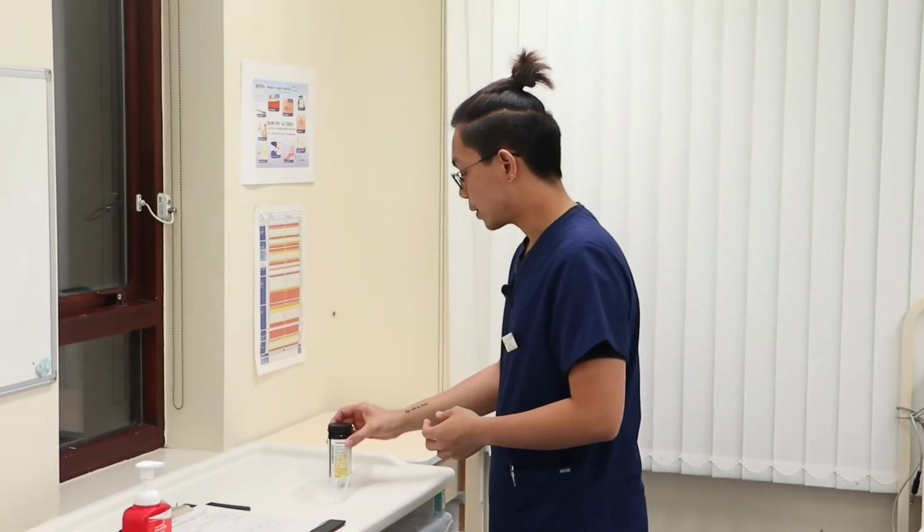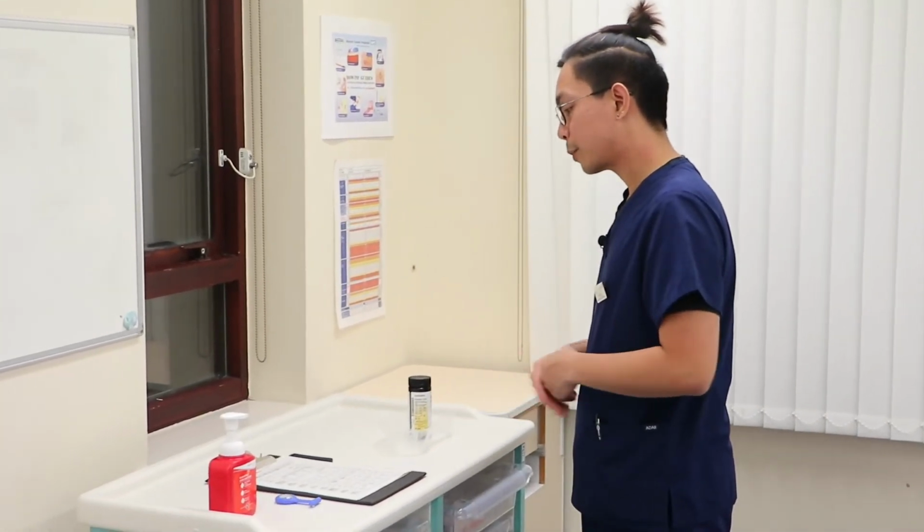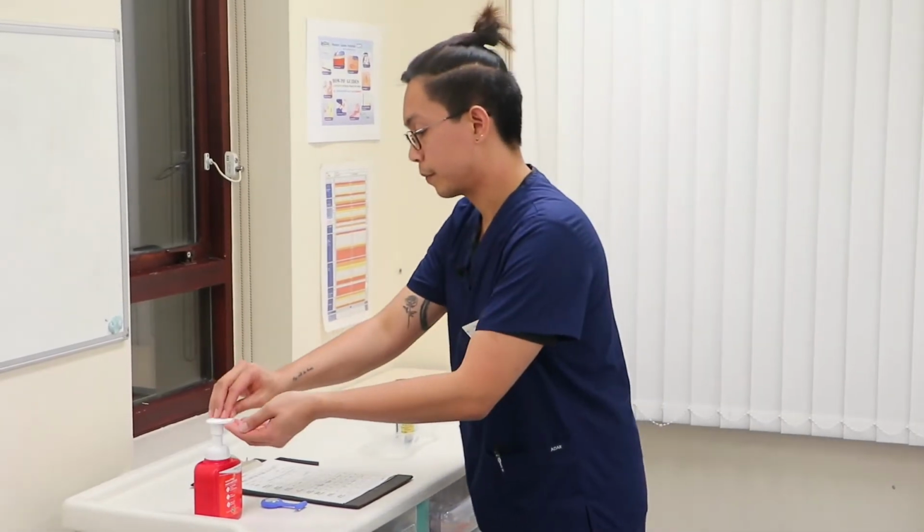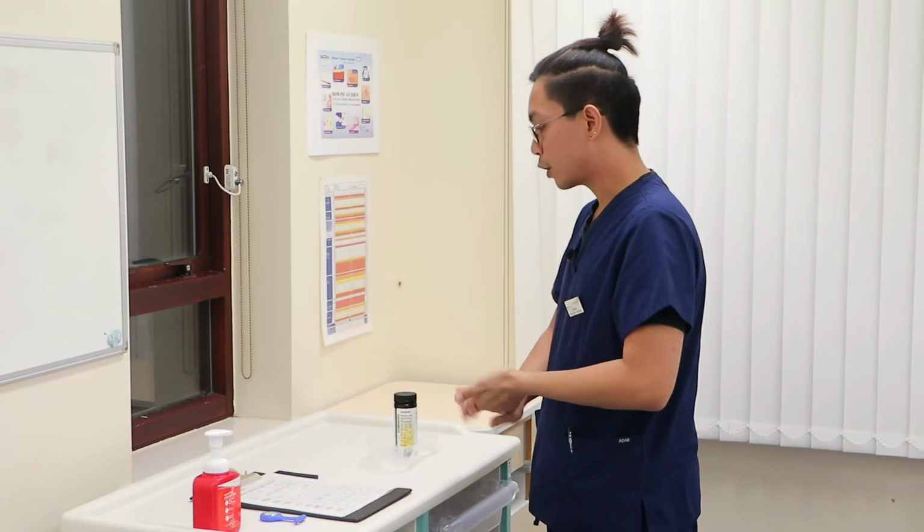So, safe for me to use. I also have my multi-sticks report form and my fob watch. Now, I'm going to do a quick hand rub and go back to my patient's bedside.